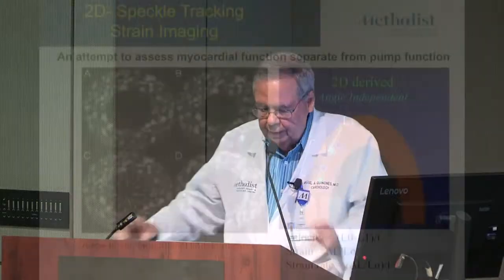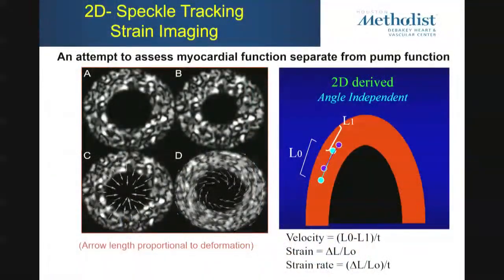All right, let's talk a little bit about strain now, which is the new kid on the block, but not so new anymore. It's been around for a while. And like many other things we do now in echocardiography, strain is a product of the digital technology.